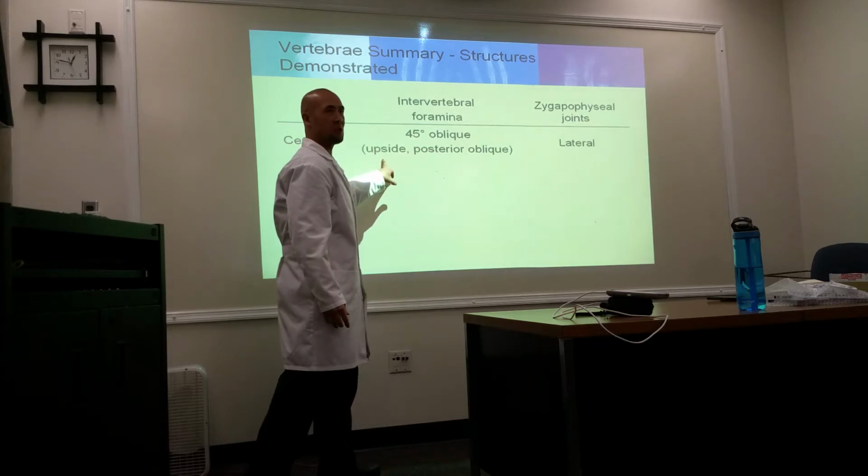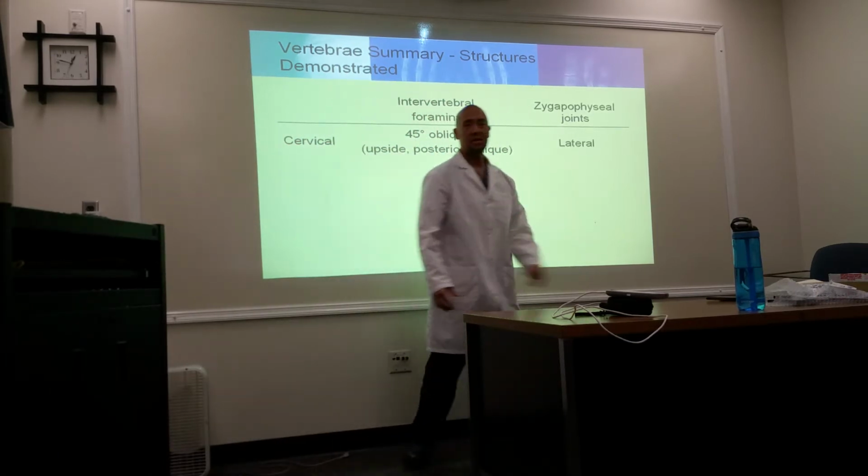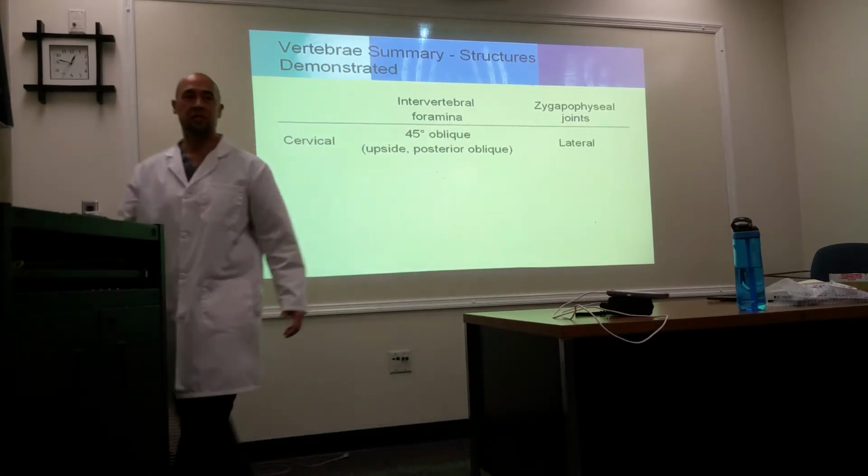Looking at the side furthest away from the image receptor. To visualize the zygapophyseal joint in a C-spine, it's in a true lateral position.